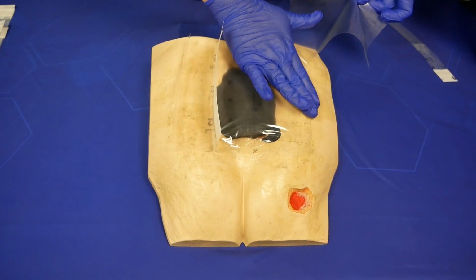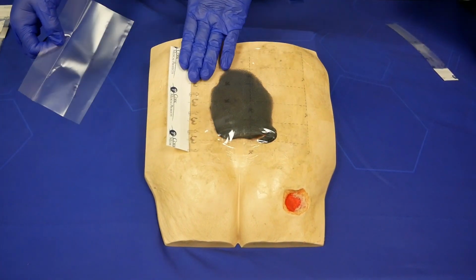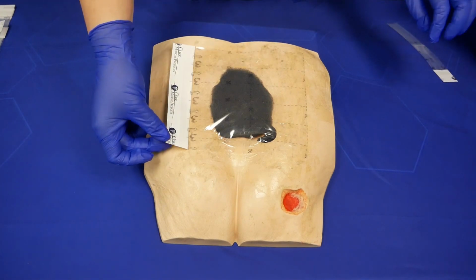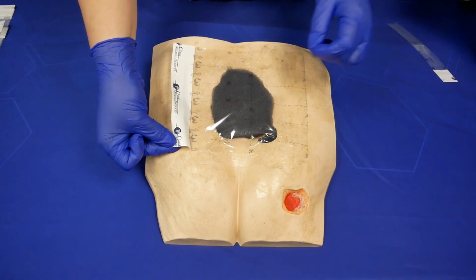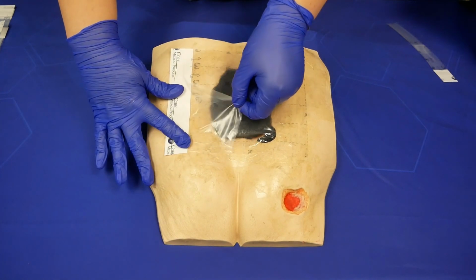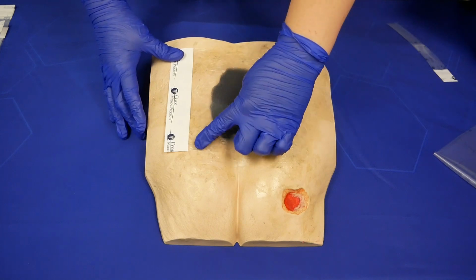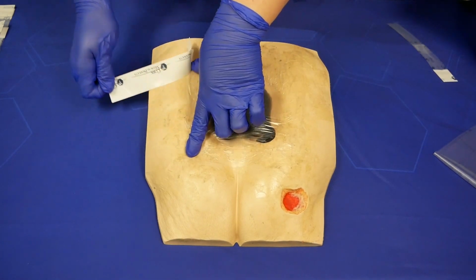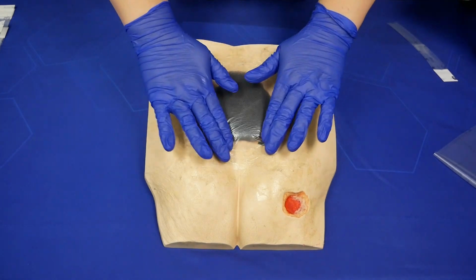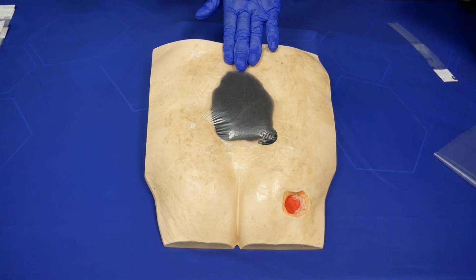And we just peel these out from the bottom, seal it as we go. Then again, I like to pop these corners up to make this top piece stand up. You can feel it even with gloves on. And again, the last step is to peel that off. And again, I typically go around just to make sure that that's really secure in place.